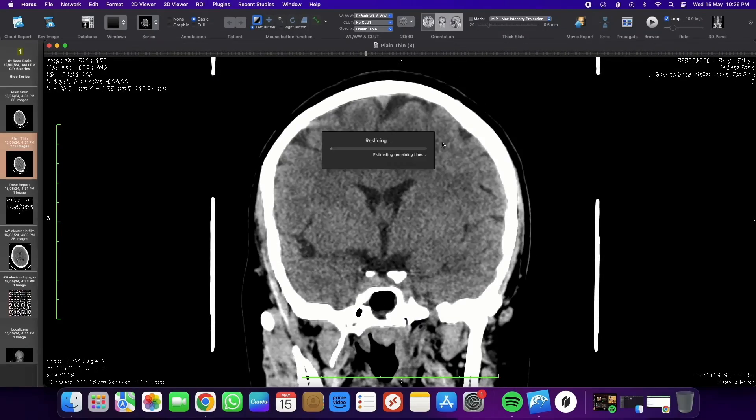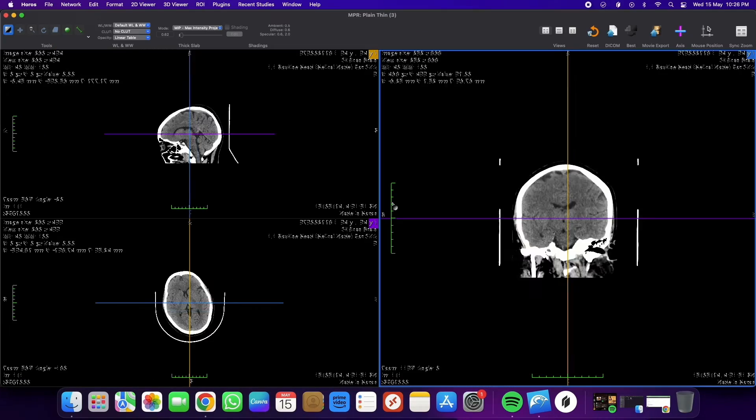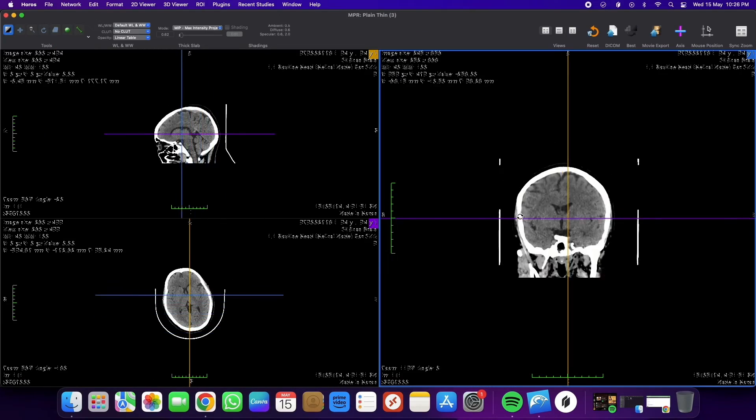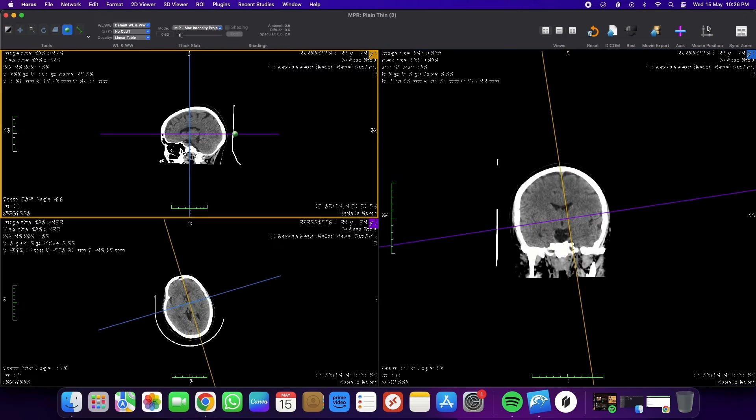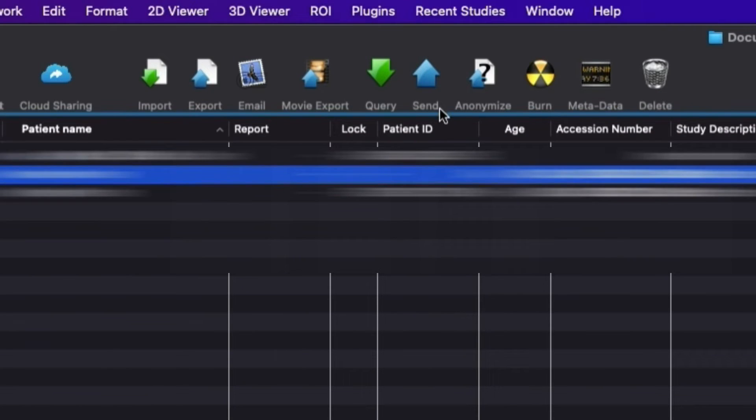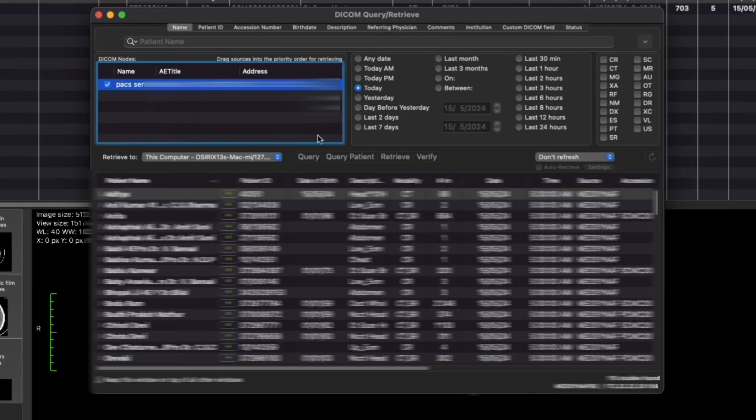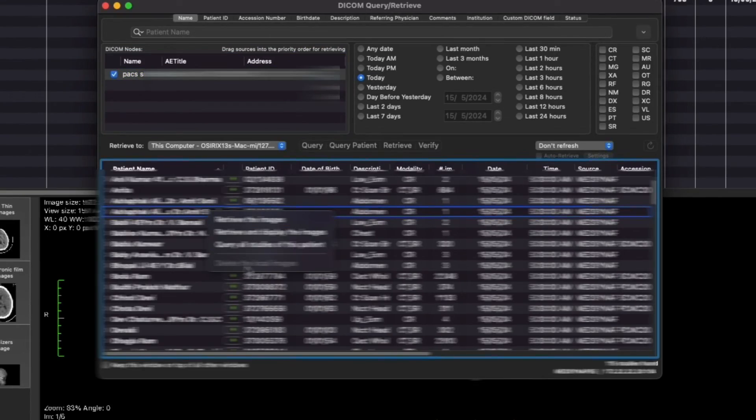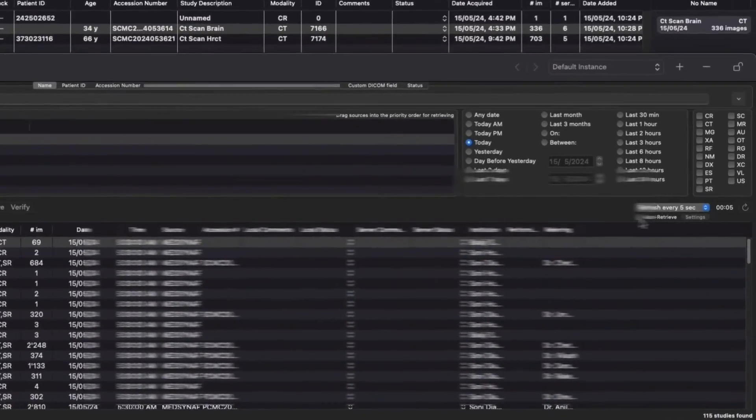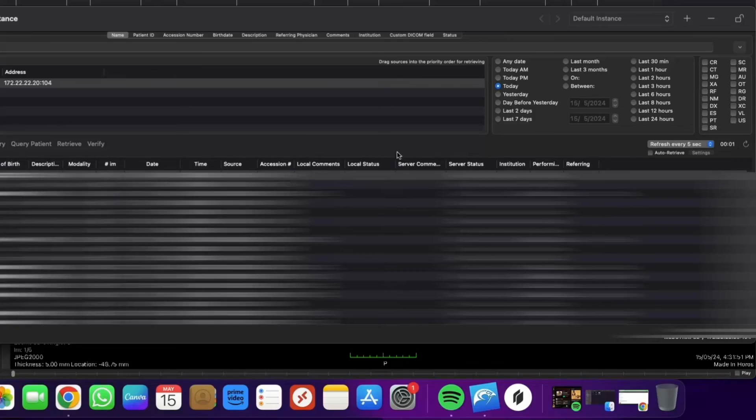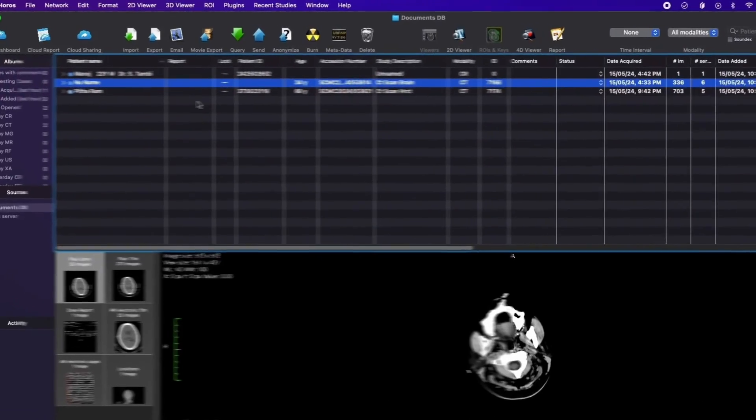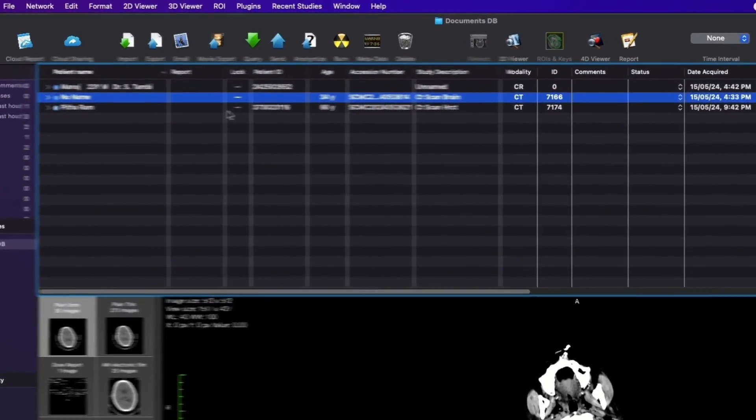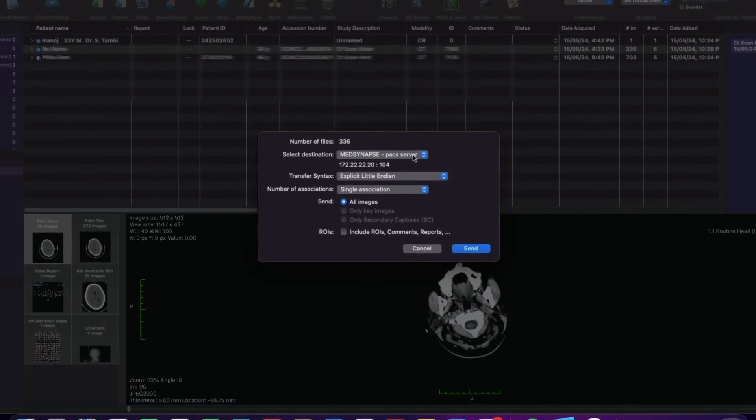You can perform 3D reconstructions with just a single click. This software has a useful feature called Query and Auto-Retrieve, which allows you to automatically get images from the PACS or other DICOM-based workstations. You have different date filters and auto-query and retrieve buttons to fetch images automatically for doctors.